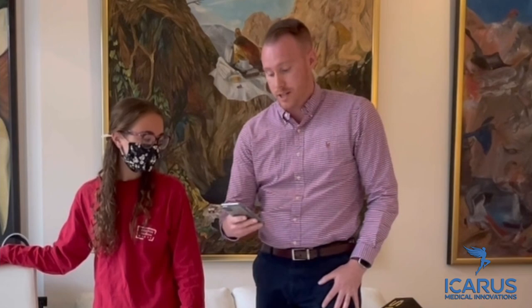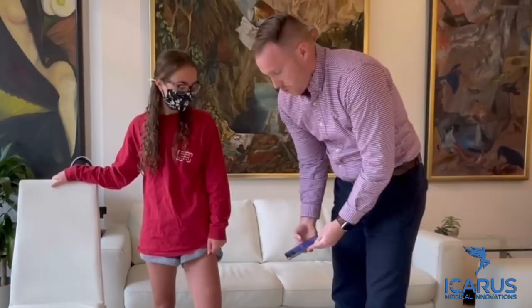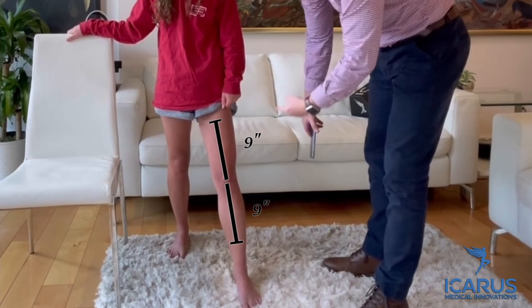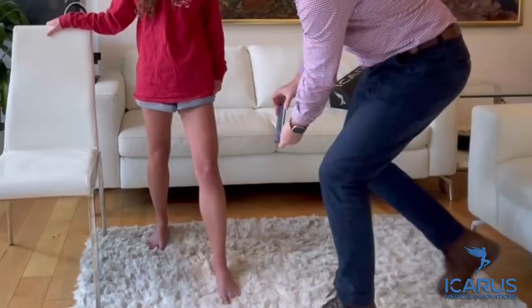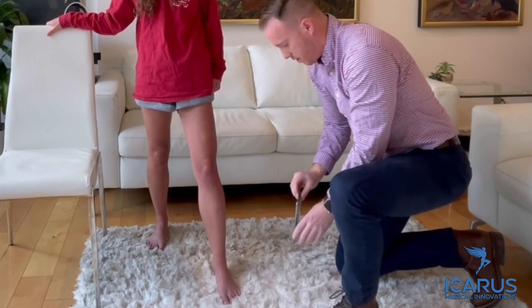Open your app to the home page. You're going to use the front-facing camera — flip the phone so the camera is on the bottom. You will use a slow, steady sweeping motion, nine inches above and nine inches below the knee. Make sure your patient stays stationary, and hit the center record button. You're looking to capture the whole way, 360 degrees of the leg.